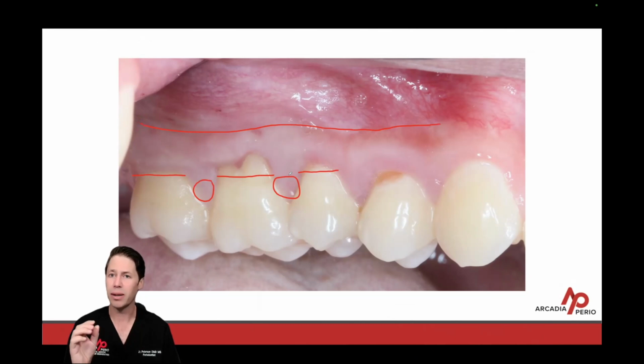The other thing when it comes to treating these cases that I need to be mindful of is what does the bony architecture look like? Is there a big bony ledge 2 or 3 millimeters from the start of the root? Or is it really flat? This will help determine whether I'm going to take a tunneling-based approach or a full thickness flap-based approach. So all things to consider.